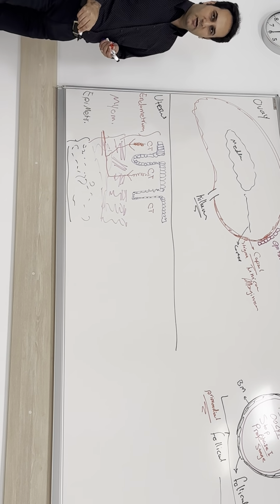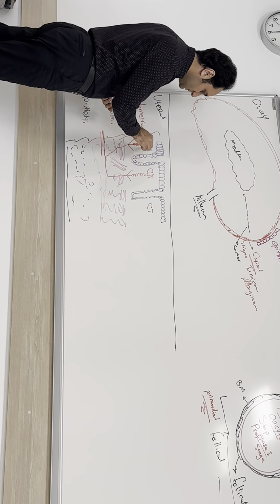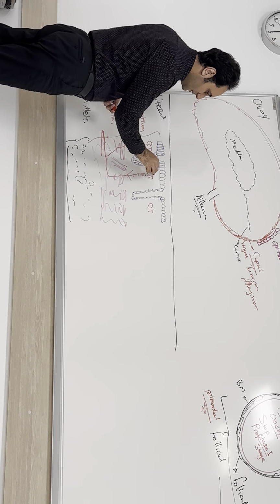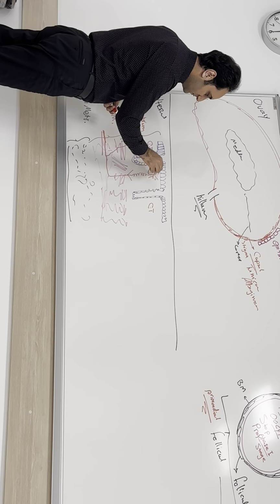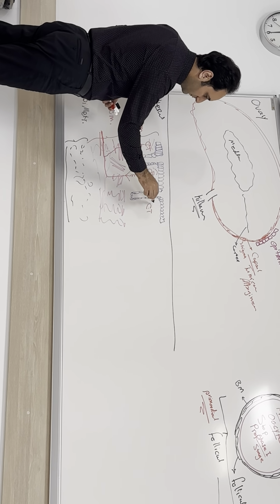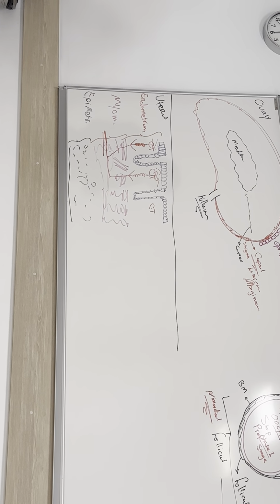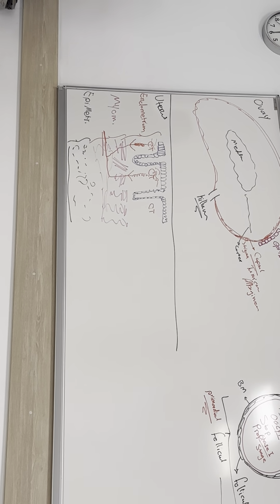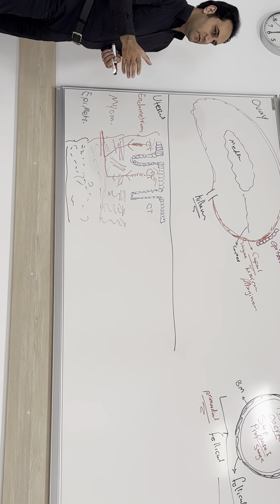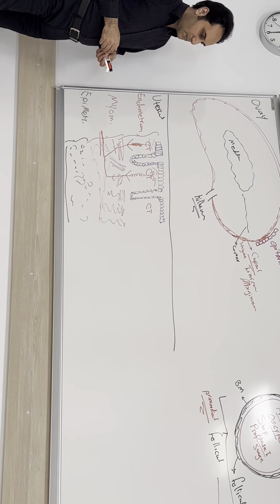Spiral arteries go to the upper side of the endometrium and in these parts form the capillary network and also form the area for collecting of the blood. Here you can see these areas.